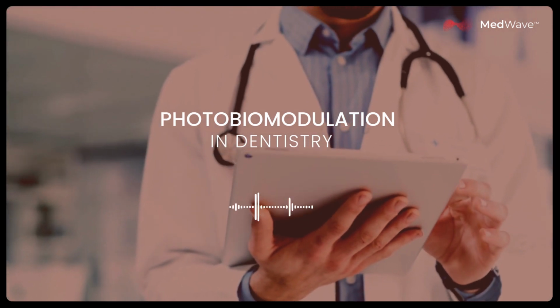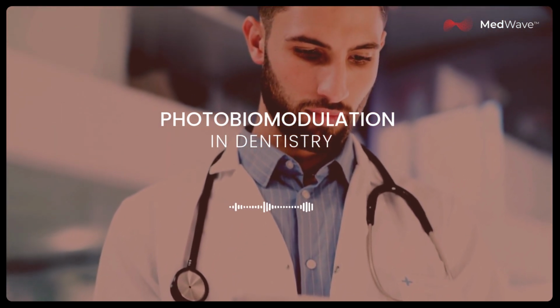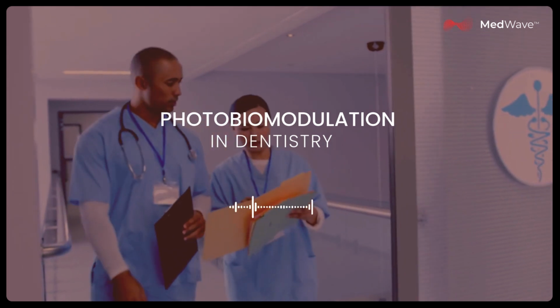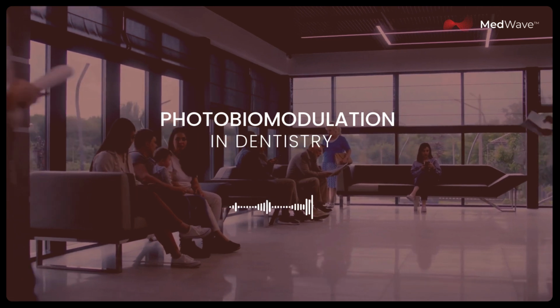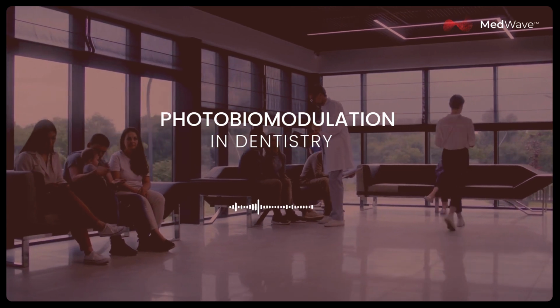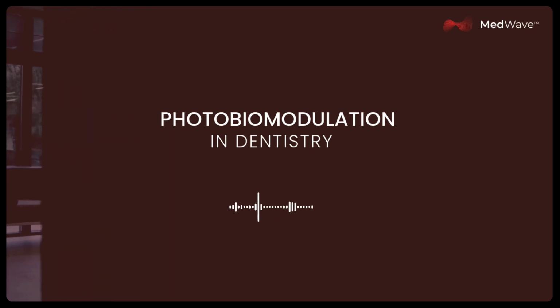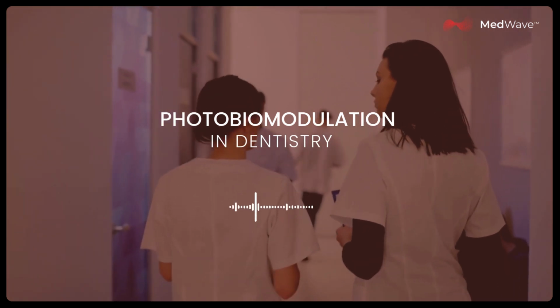And while MedWave has chosen to focus on those two wavelengths, it's worth noting that research on photobiomodulation is exploring a much broader range of light. For instance, some studies have investigated the effects of a 940 nanometer diode laser on dental implant stability, while others have looked at the impact of an 830 nanometer laser on the process of osseointegration. That's how well the bone bonds with the implant. So it's a diverse field with a lot of different avenues being explored. It's like researchers are piecing together this giant puzzle, with each study adding another piece to the overall picture of how light can be used to promote healing.